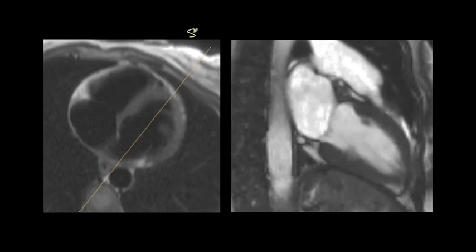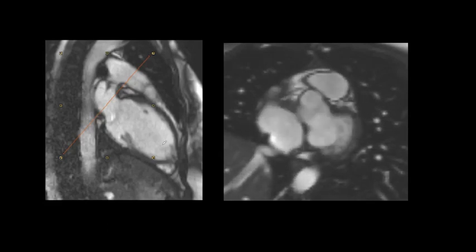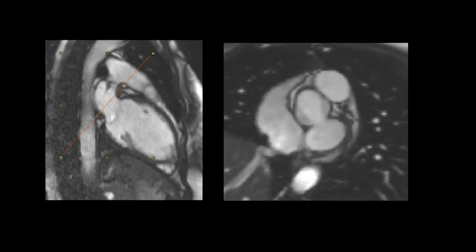The cine sequence is the SSFP, which is steady state free precession. We use this acquisition to plan the next slice. So this is the VLA. We call it VLA, which is vertical long axis. So now we cross-cut at the middle of the atrium, parallel to the AV groove or to the mitral valve, and you got this short axis where you can see your LVOT part of the aortic valve.